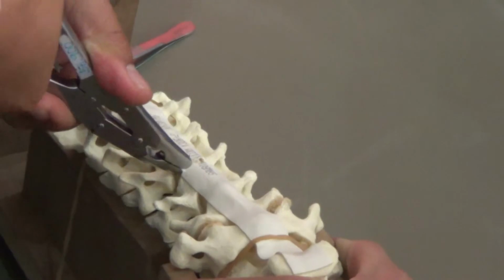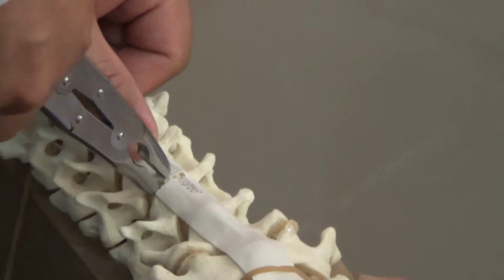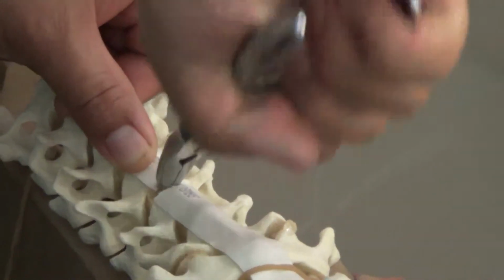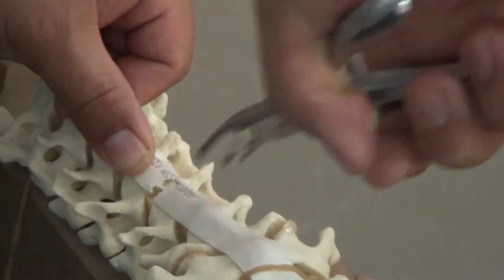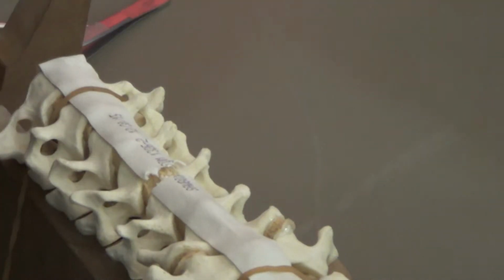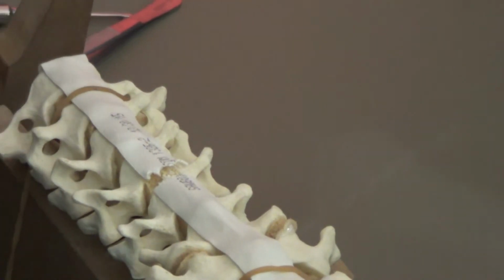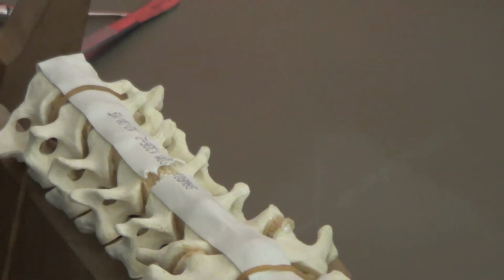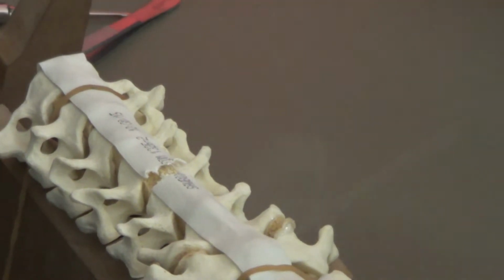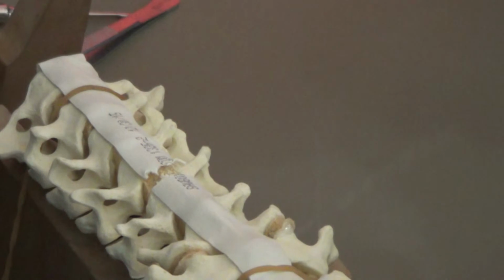Professor, do you use a microscope for cervical disc? After we see the disc, I can do it without any problem without the microscope because my visual acuity is very good. You don't have a carousel here. What's the purpose you use the microscope? Better visualization, and for my assistant doctors and nurses, they can see simultaneously on the TV, the same vision.